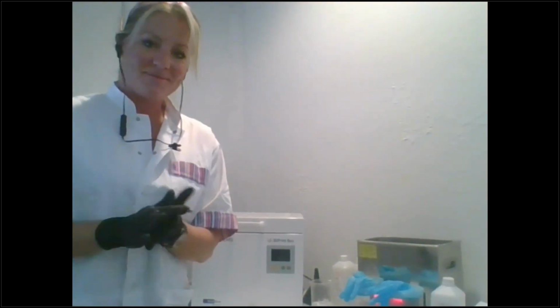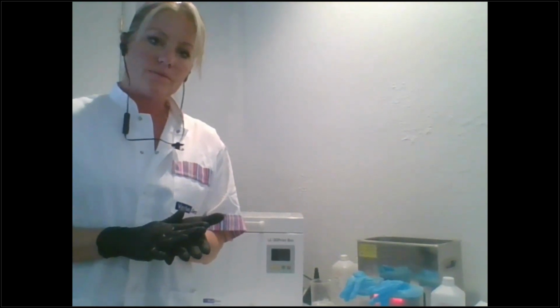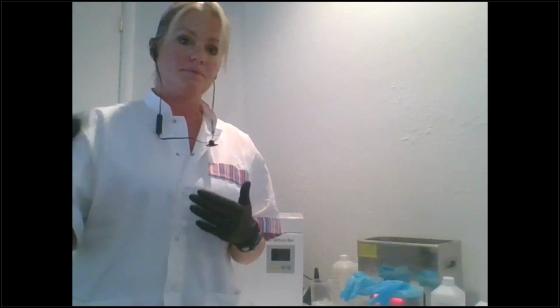Okay, thank you. Anything else? From when you were nesting before, someone was also wondering, they were saying the time that is required to print a job on their printer seems significantly different compared to the actual amount of time. Is that a typical thing, or is it a problem specific to them? I'd say it should be within 2 minutes. There was a problem a couple of versions ago that it was pretty far off.